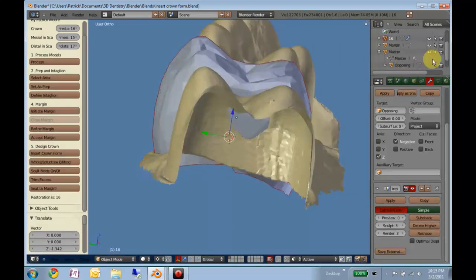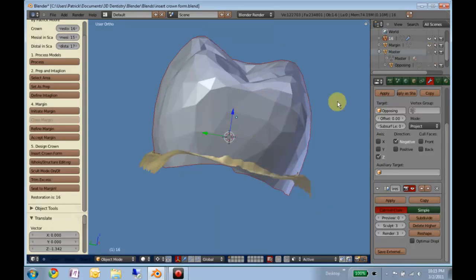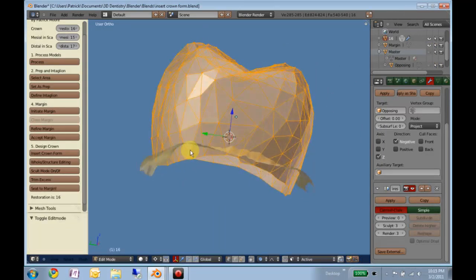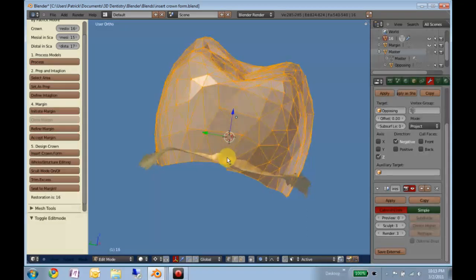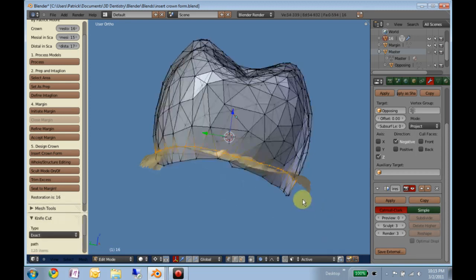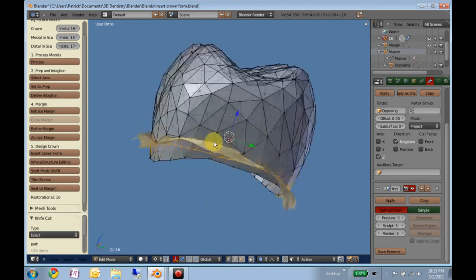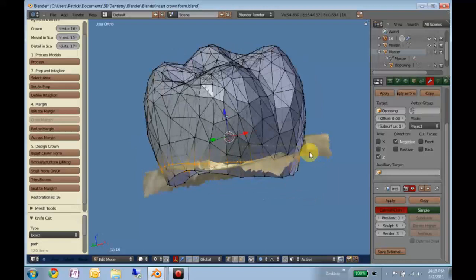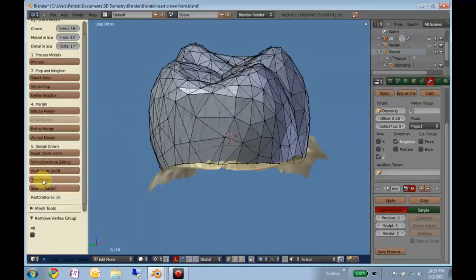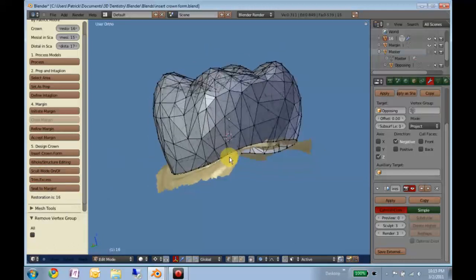So what we'll do at this point is turn that off and go into edit mode. We just want to clip off this excess. You don't have to be super exact, but look at it from the mesial distal. Hold down K for knife, and just snip that off. And that's great, it just needs to be approximate. Right here, you hit trim excess, and that will go away.